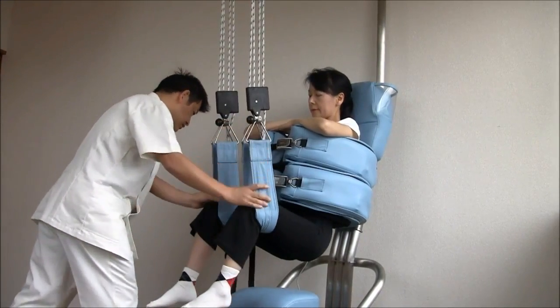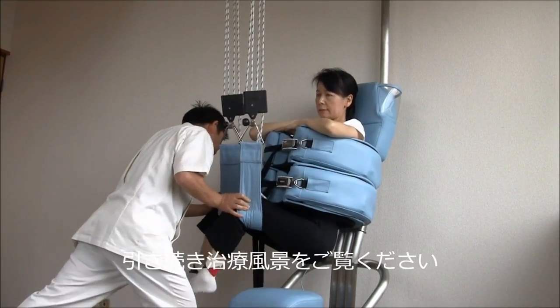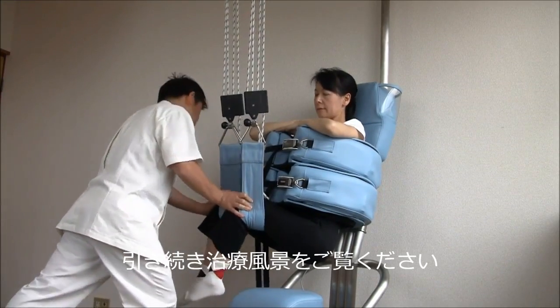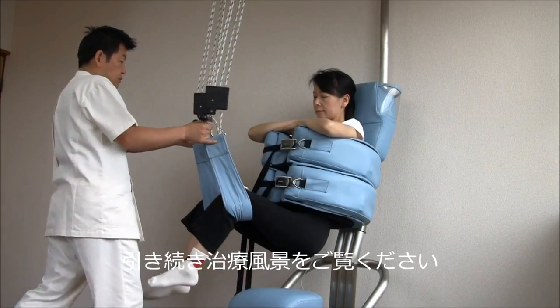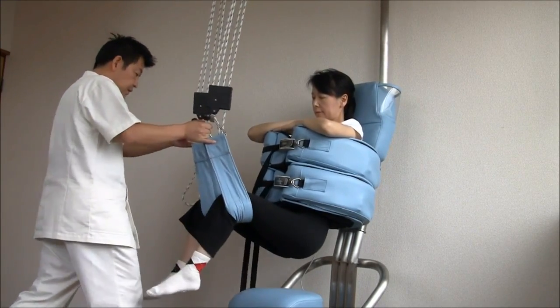Make sure to ask the patient if they are experiencing any pain when performing these maneuvers. Stop the exercise if the patient is feeling any discomfort. Please look over the videos to observe how these steps are taken.